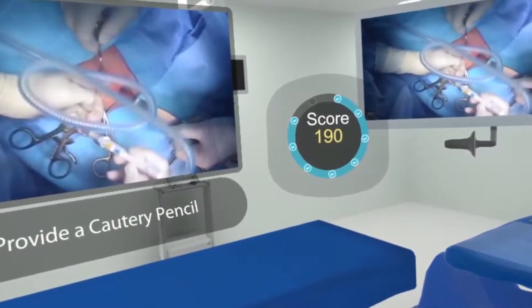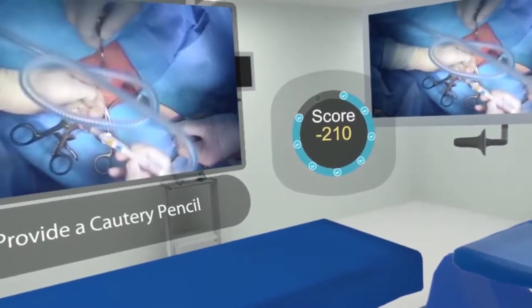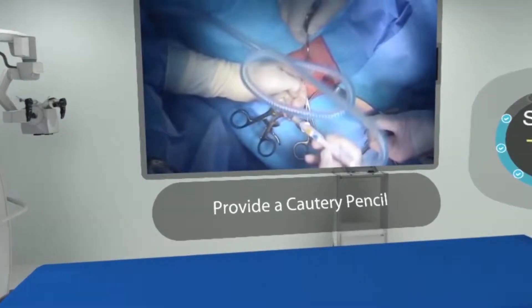The other thing I'm going to show you is if we put our hands below the table, I will also get penalized. 'Hey, keep your hands above the table.' So we implement scoring penalties to ensure that learners learn not to do those things.